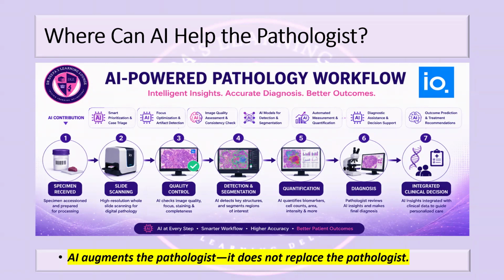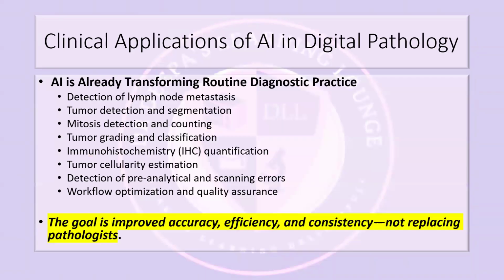And then there may be some whole slide image that is not scanned well, and there's nobody who rejected it. The technician forgot to reject it properly. Then I have to redo that. So these repetitive, redundant things that I usually do, that any pathologist is frustrated about, are certainly something that AI can eliminate. So it is your partner that will help you do better. That's why I said this is the entire workflow on your screens. Whatever you're seeing is the entire workflow where AI can work for you.